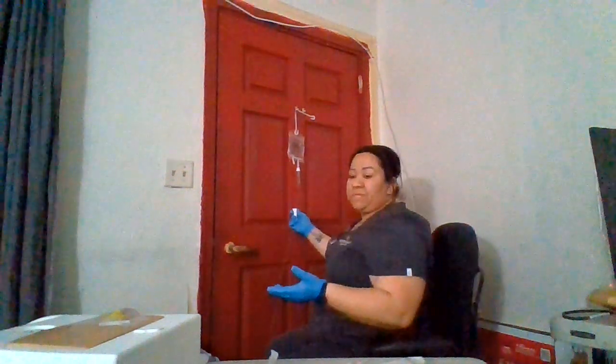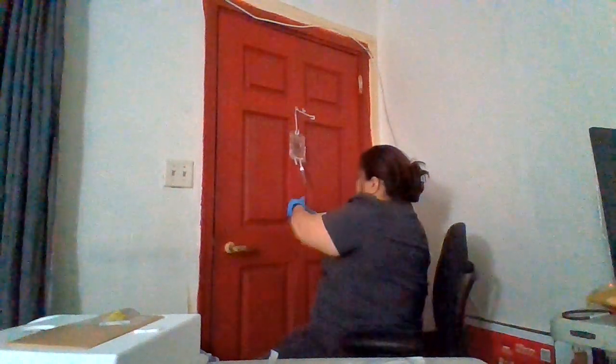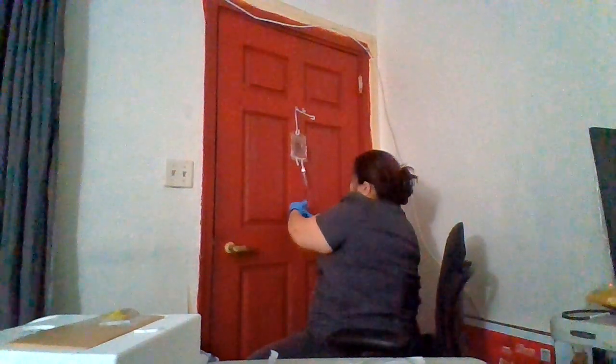For demonstration purposes, I will be clamping down the roller clamp.